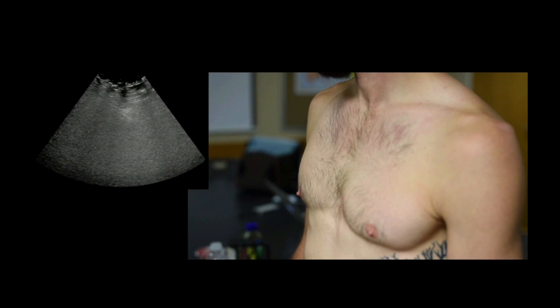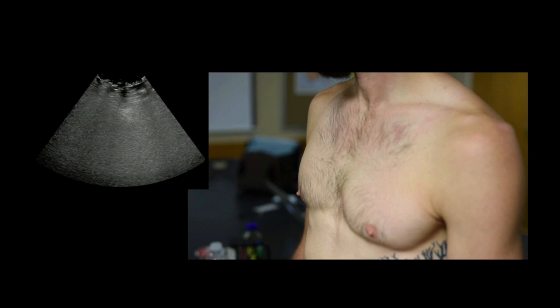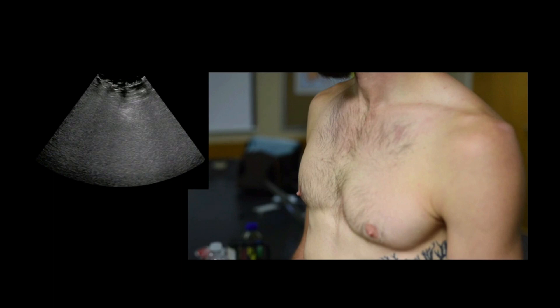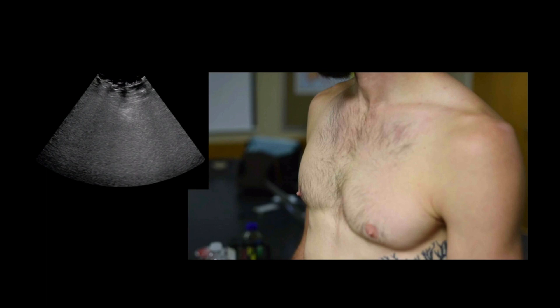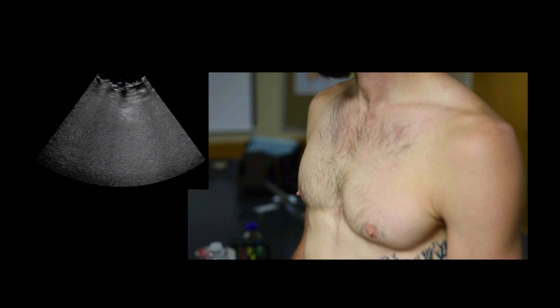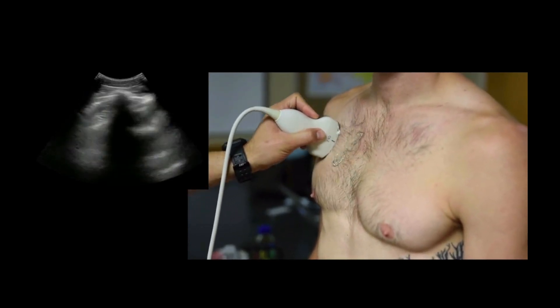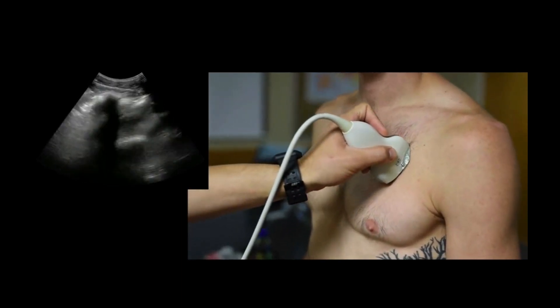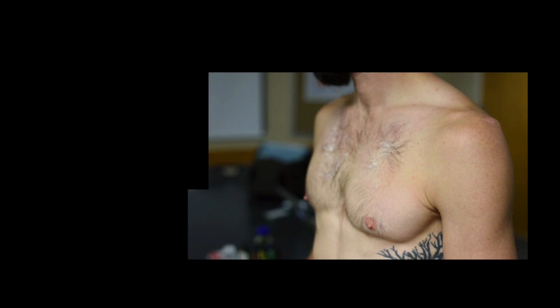If the most likely diagnoses are pneumothorax or pulmonary edema, I start in the anterior fields because that's where you're more likely to see them if abnormal. Now for pneumothorax it's probably good for the patient to lay flat or at a 30-degree angle, but for a patient with cardiogenic pulmonary edema or CHF exacerbation, they won't want to lay flat. So I basically have the probe in an upright orientation — probe marker facing up — and scan the anterior chest. I have the probe marker facing up so I can see where the pleura is relative to the ribs and don't confuse subcutaneous emphysema for an actual pleural line.